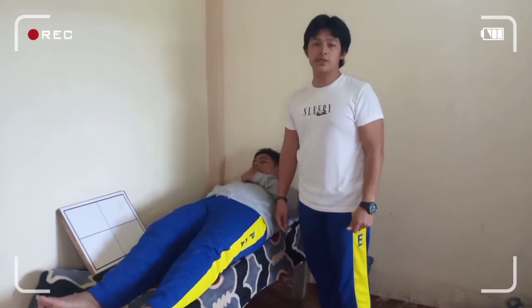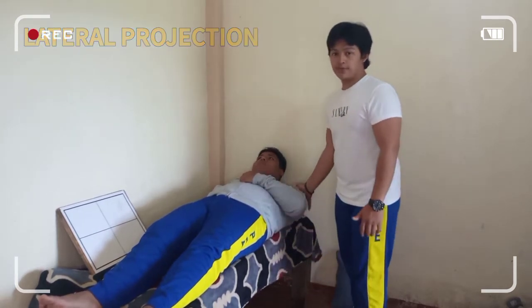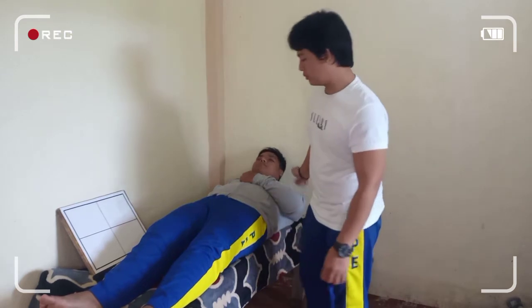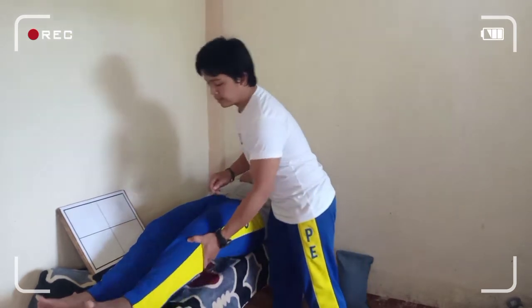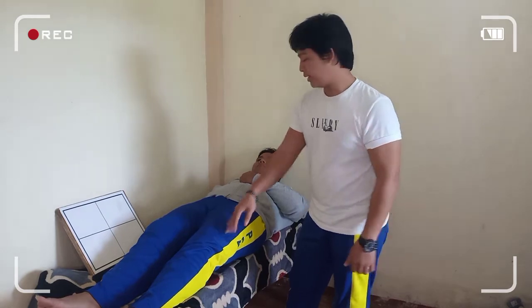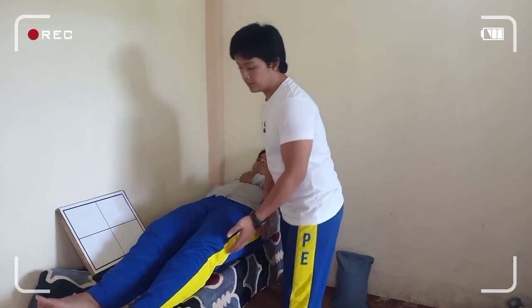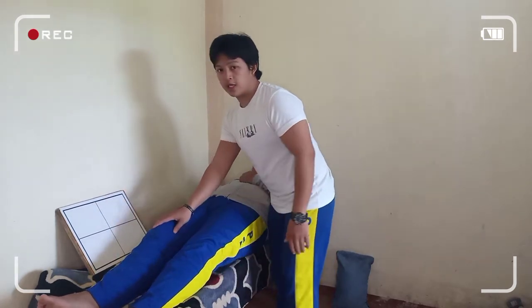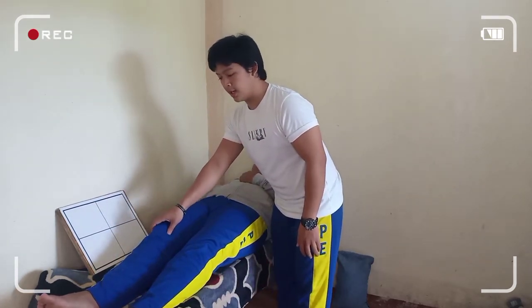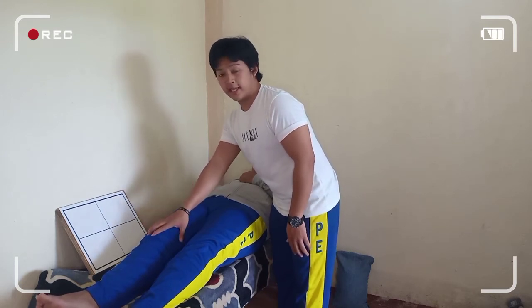The second projection is the lateral projection of the leg. Have the patient in supine position. And guys, para ma-obtain yung ating lateral position ng ating leg is pwede nating i-side yung ating patient. Since ang kukuhanan dito na part is yung ating affected side, which is yung right leg.